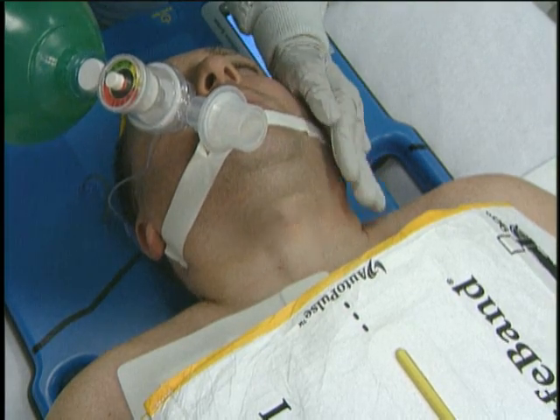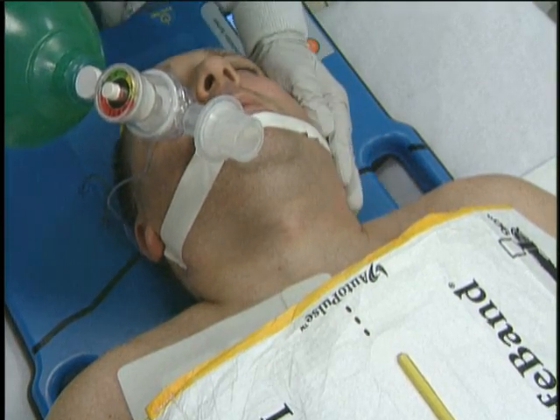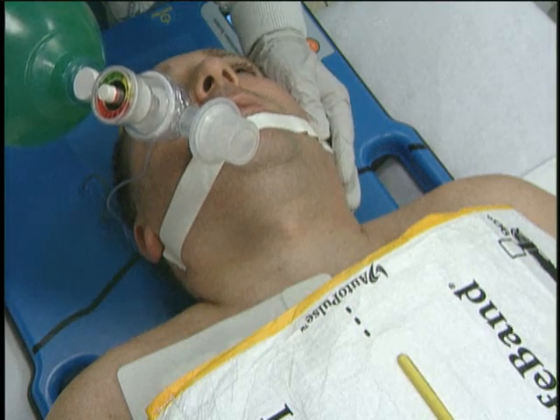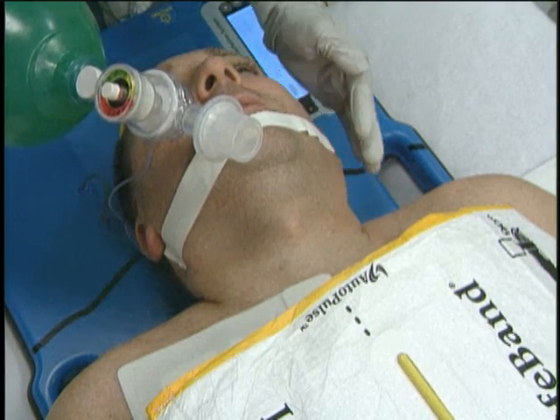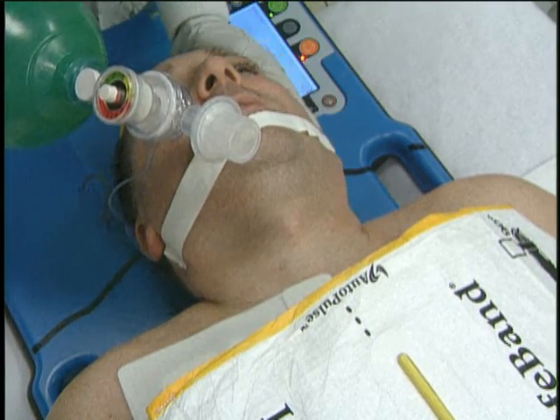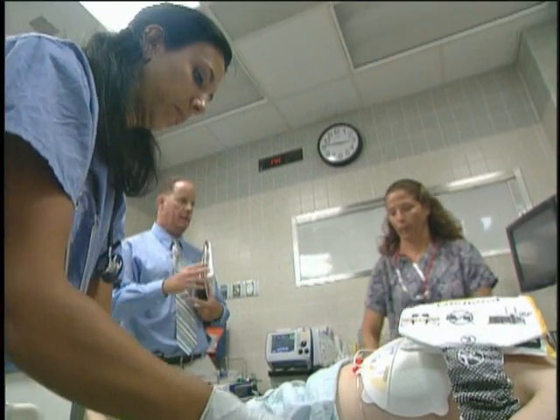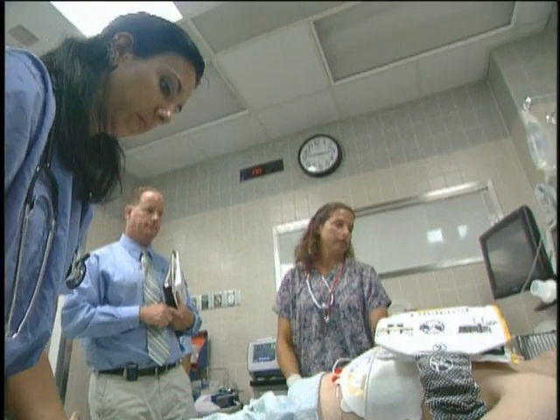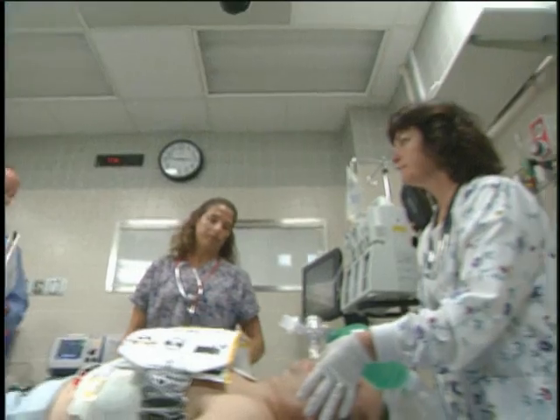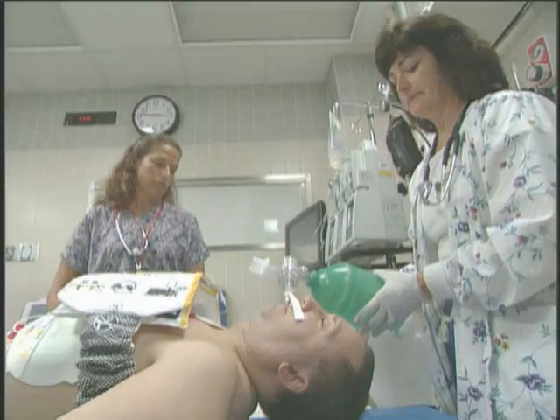Let's get a second IV. Let's check a blood pressure, please. You're okay, Mr. Spinetti. Let's get a second IV going. We'll check a blood pressure. I'm going to talk to the family — she should be in the waiting room. Any thoughts, anybody? We're good. Thank you all. You did a nice job.